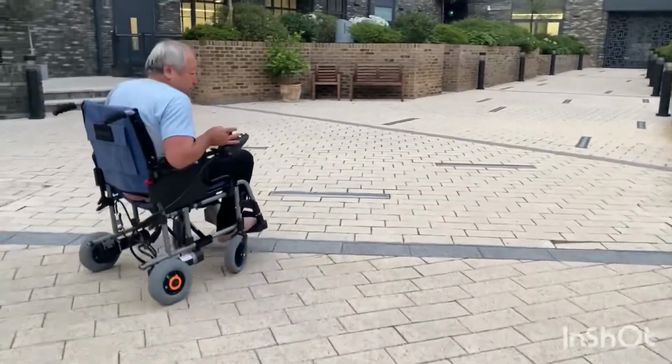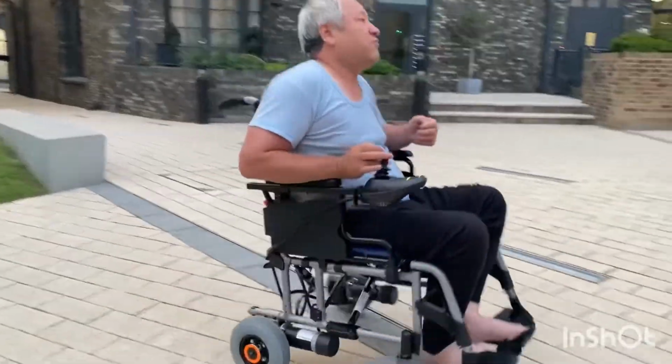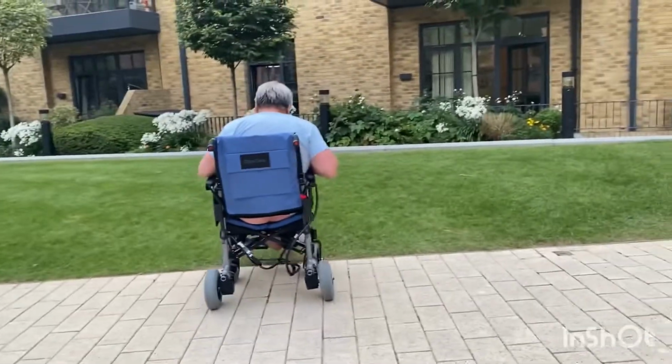We were just looking at whether we were going to buy an extra battery so we have both of them charged, so if one runs out in the middle of the day we can just switch it out for the other one, which will be fully charged.